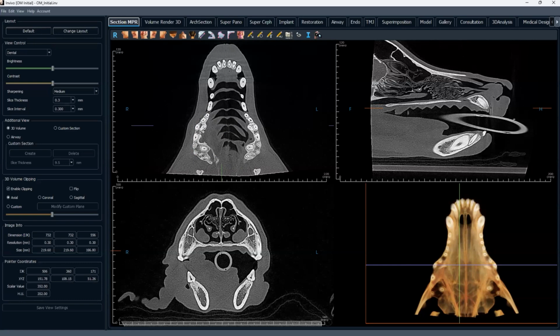Ultimately, what we decided the margin is that this is a very superficial bone invasion, and that we want to take out the caudal maxilla, including the teeth, from about the second premolar all the way to the caudal extent of the maxilla. But because it's so superficial and because it's only palatal, there's nothing in the buccal bone. There's nothing that appears to penetrate the plate of bone, so we can probably spare the infraorbital foramen.